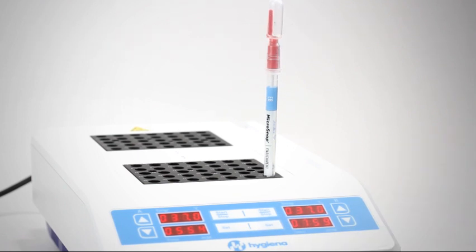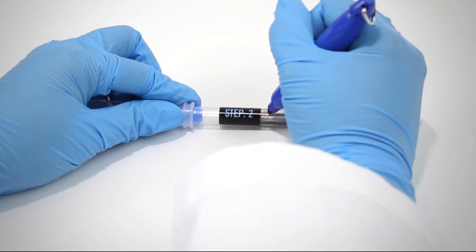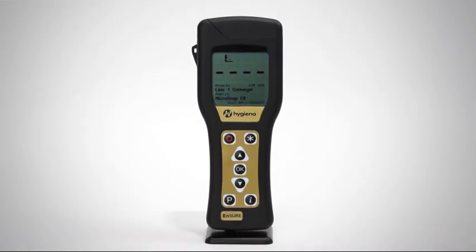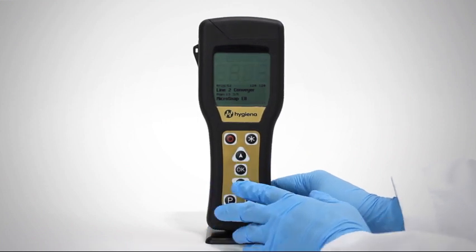Refer to the complete instructions for details. The second step is detection. Allow the detection device to acclimate to room temperature before testing. Write the location or product on the tube label for easy identification. Turn on the Ensure Luminometer. If you program locations, select the location to be tested.